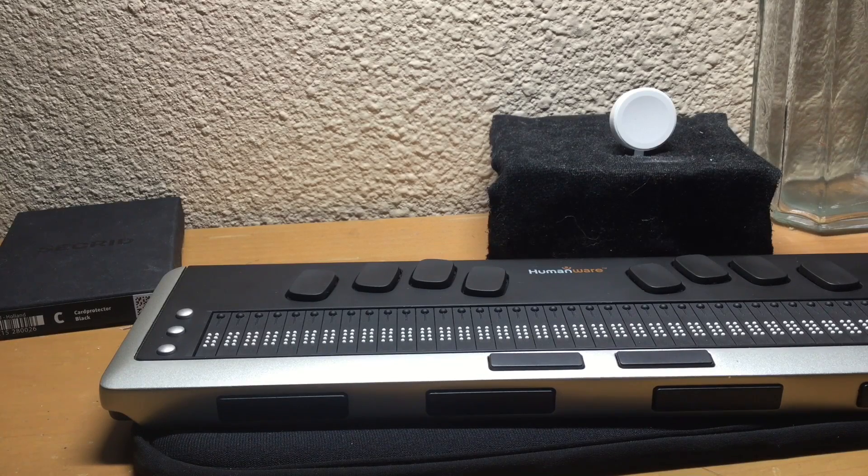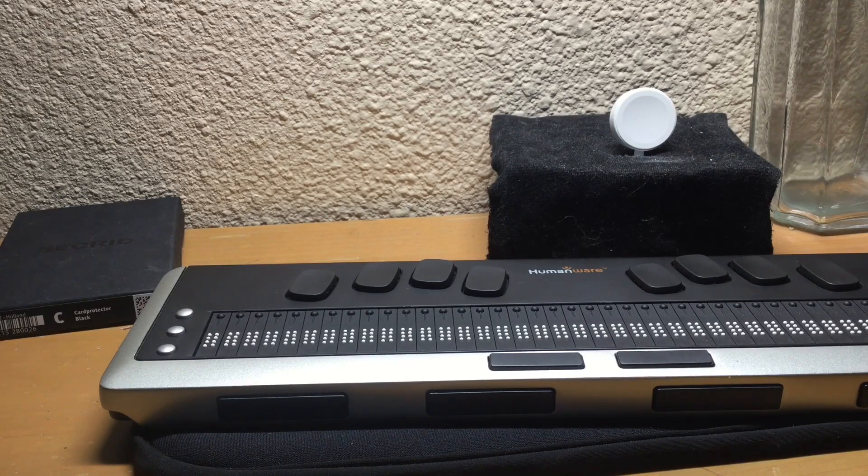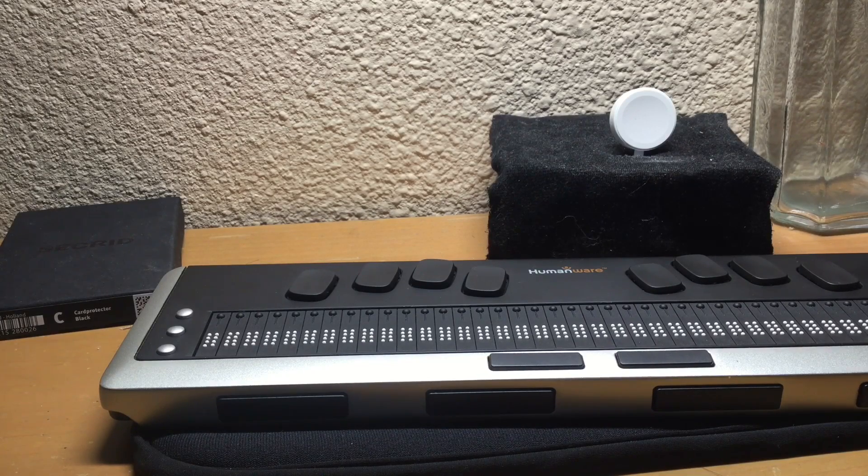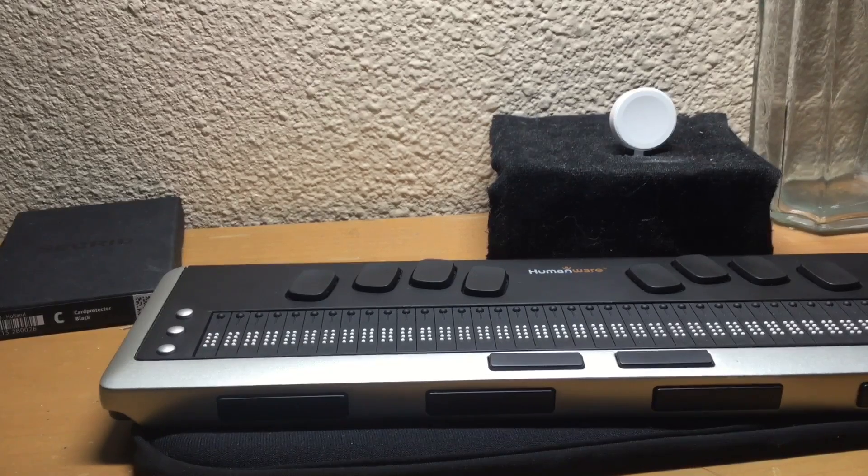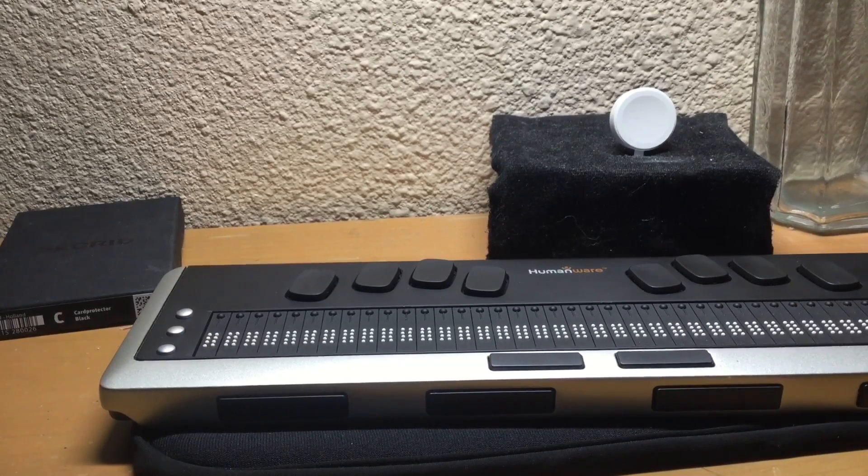Hi, my name is Cesare Ruiz and today we're going to be taking a look at a Braille keyboard for your iPhone.